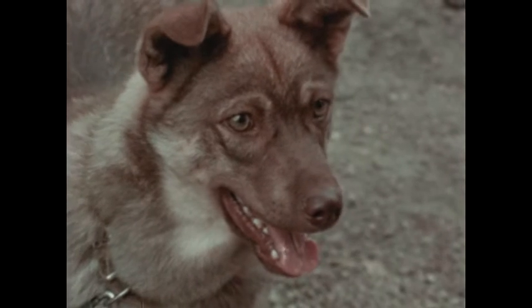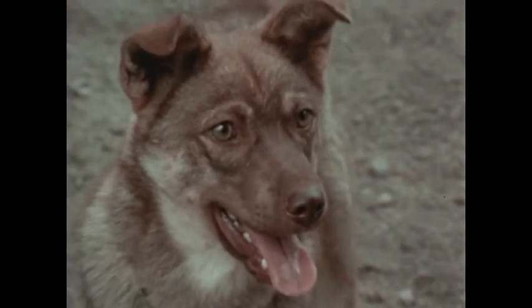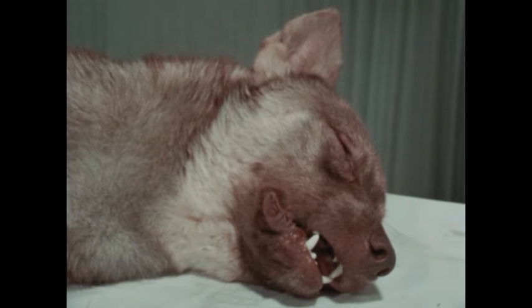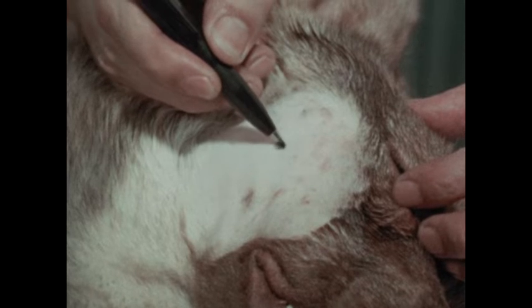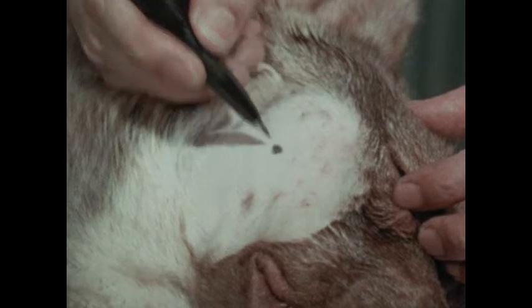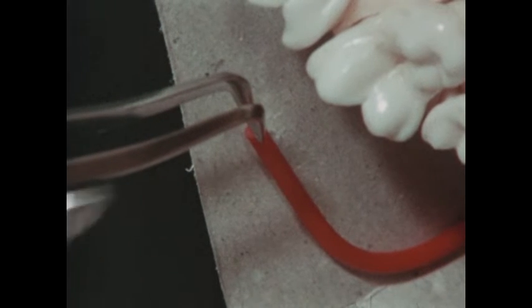In our experiment, we'll want to measure the amount of saliva being produced, and we can arrange that by a simple and painless operation. To explain the operation, we'll use our model. First, part of the duct is loosened.